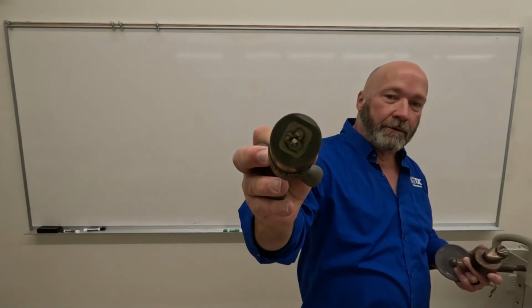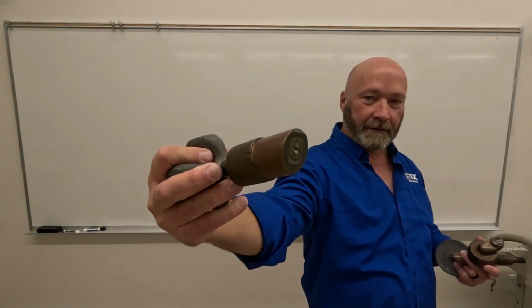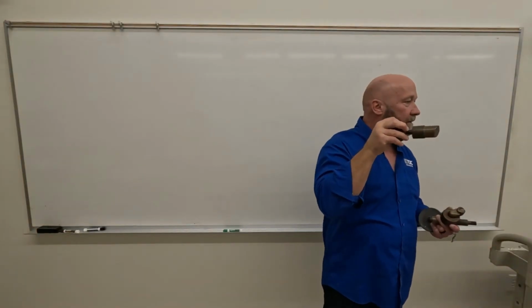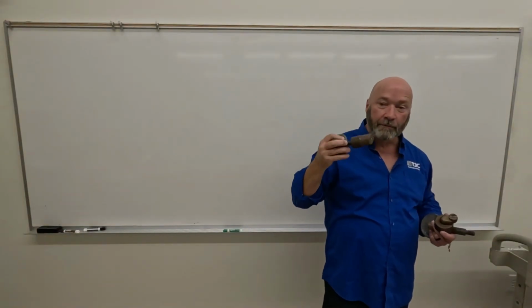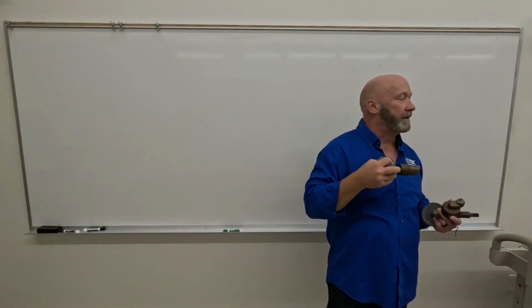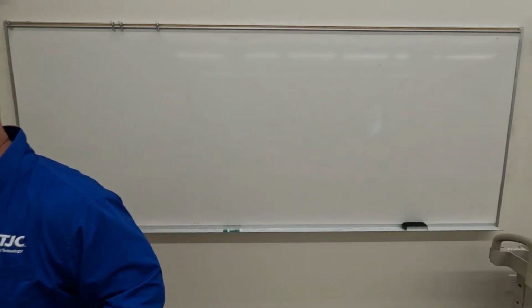And since they do, what you get, and I'm trying to make that where it can be seen on the video, is a melting of the anode. So the reason we rotate the anode is to spread that area of bombardment out so that it extends the tube life and doesn't melt the anode. We're still going to have some problems with it.